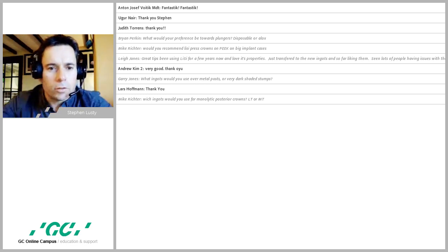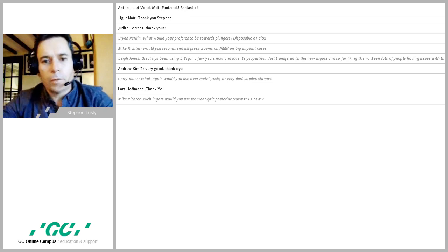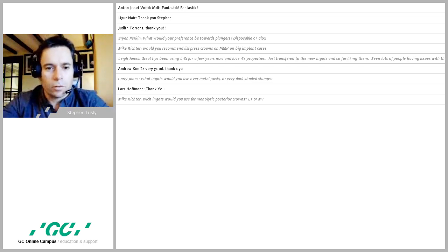Okay, so Lee Jones has said that she's been using LiSi for a while now, and she sees lots of people having issues with the pressing cycle. However, she hasn't experienced any herself. Any comment on this? Yeah, the comment is really that the pressing cycle is going to be determined by your furnace and by your own techniques. I think we've all become so attuned to having just one pressable ceramic on the market that we just took their word for the way it was, and we accepted having things like reaction layer.